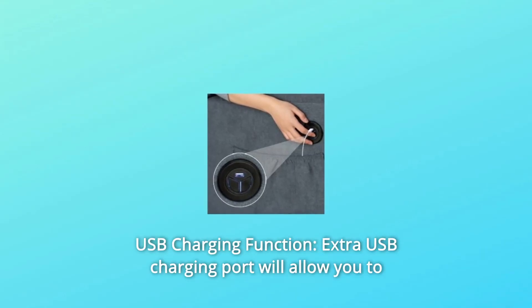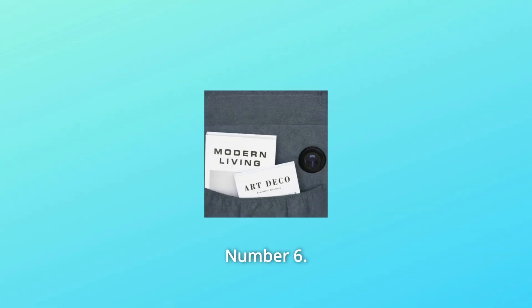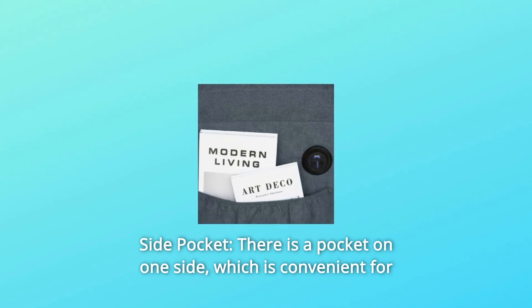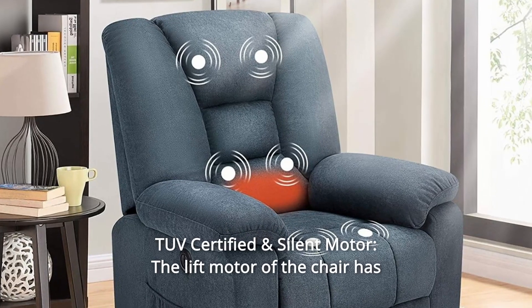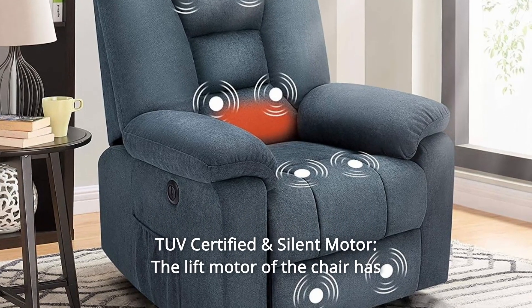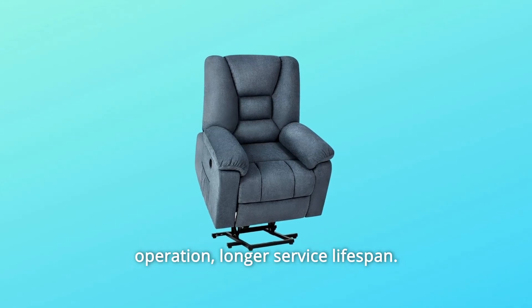Number 5: USB Charging Function — an extra USB charging port will allow you to charge your low-powered devices while sitting or reclining. Number 6: Side Pocket — there is a pocket on one side, which is convenient for small things and book storage. Number 7: TUV Certified and Silent Motor — the lift motor has obtained TUV certification, with quiet operation and a longer service lifespan.